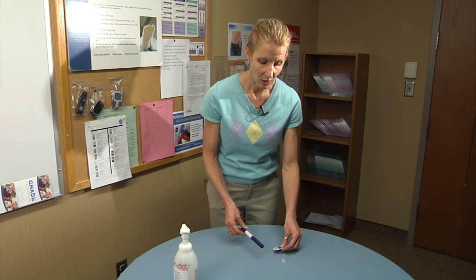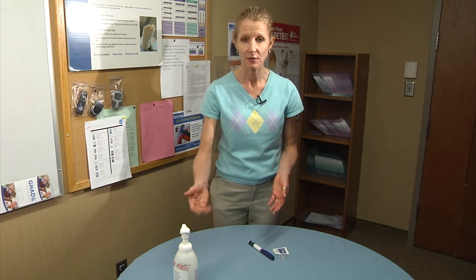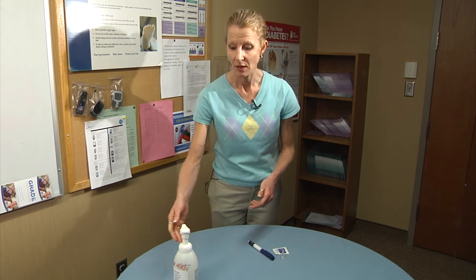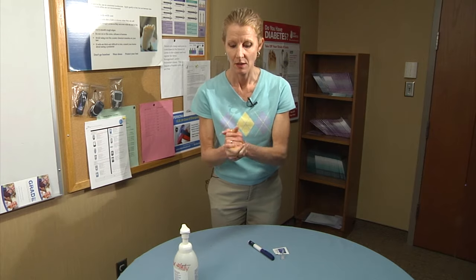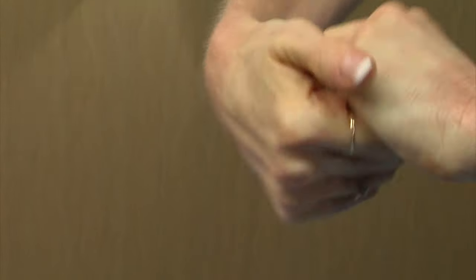First you need to gather your supplies, which would be the insulin pen itself, an alcohol swab, and the pen needle. Then you want to wash your hands with soap and water or use an alcohol sanitation solution. Rub your hands together until dry.